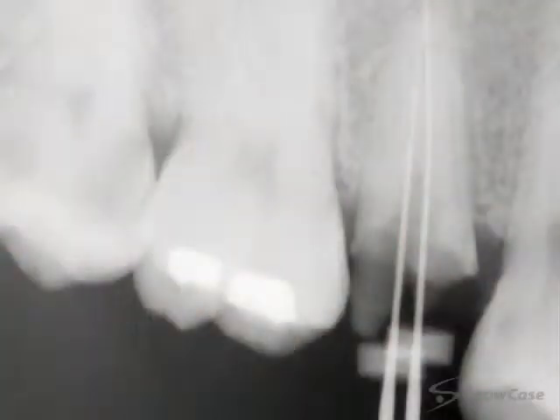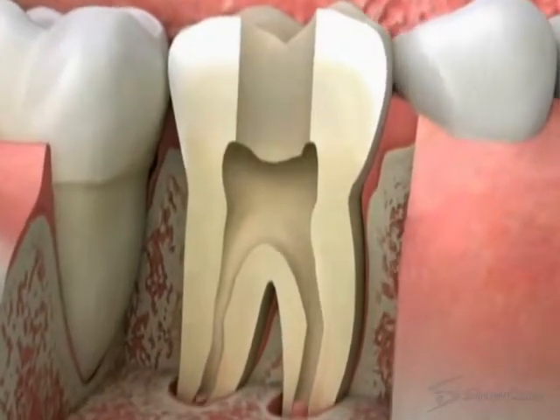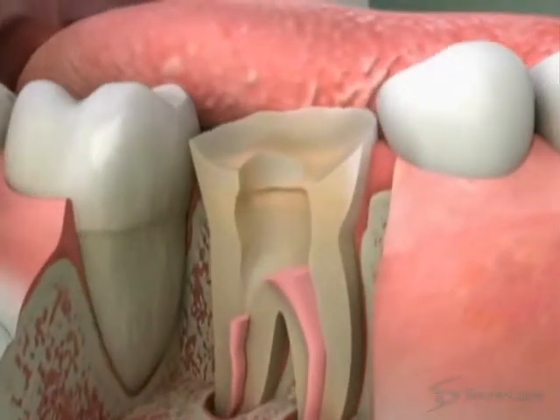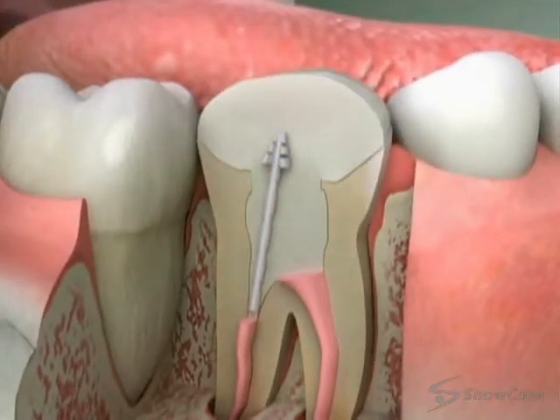We may take x-rays or use an apex locator to make sure that all of the infected pulp is removed. Then, we place filling material to seal the root canals. If the tooth is severely broken down, it may be necessary to build up the tooth with a post and core.